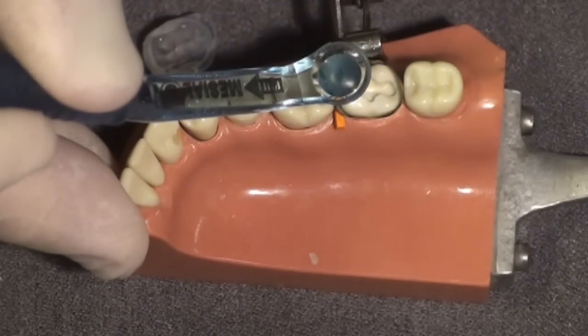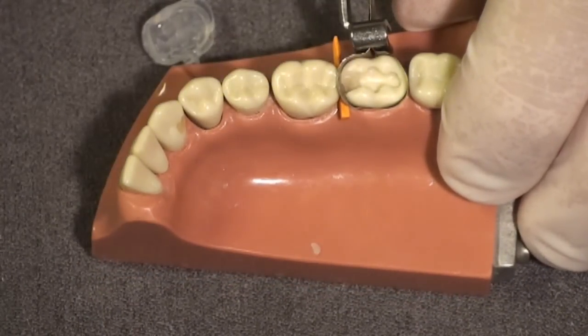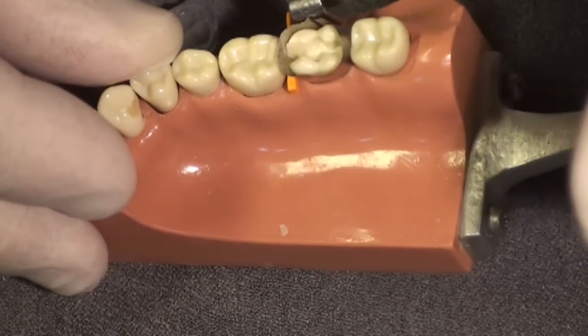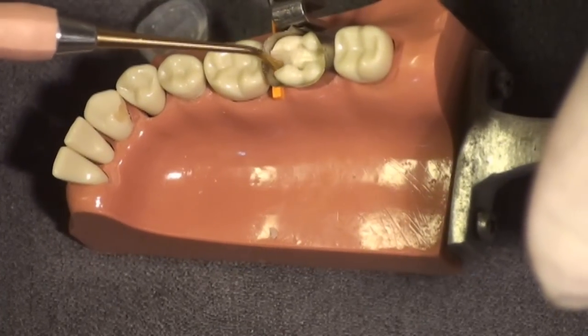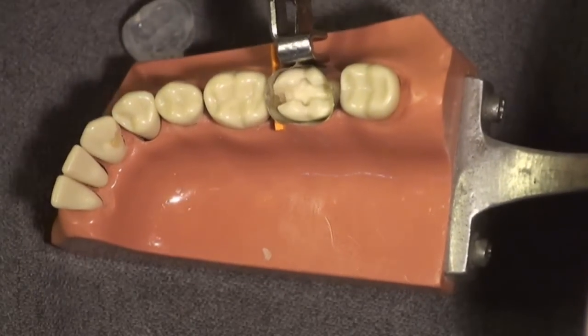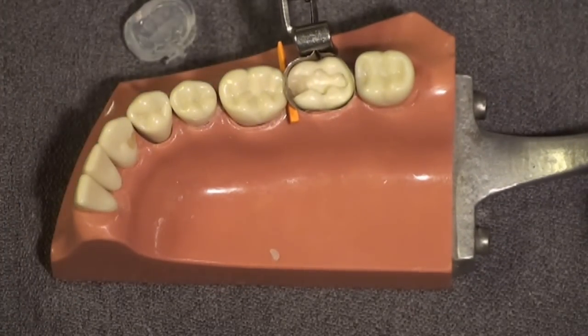After this is cured I'll try to show you this small bridge — it's somewhat difficult to see, but this will hold the matrix band in the contact while I place my last and final increment of composite. If you look closely you can see a small bridge of composite coming up the side of the matrix band, helping hold it in place while I place my final layer.